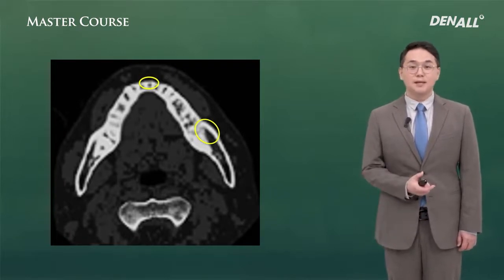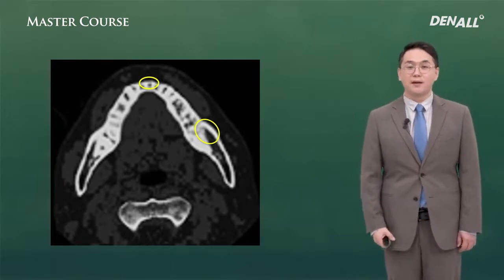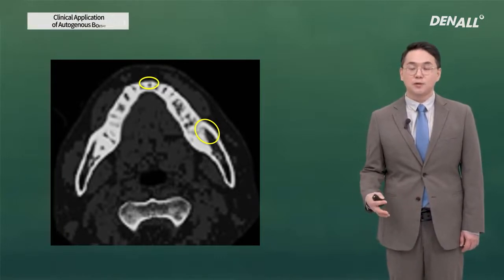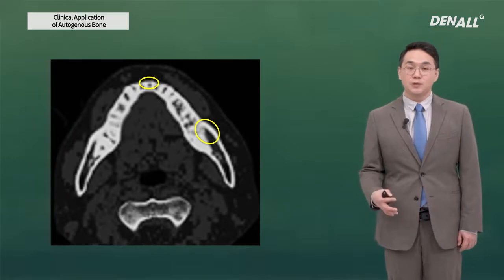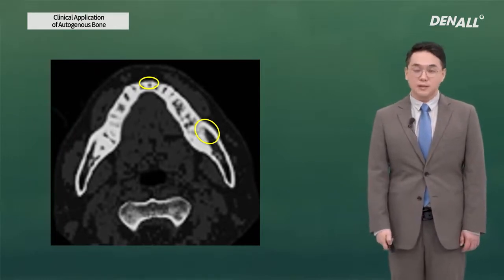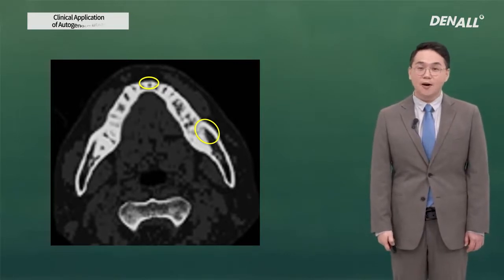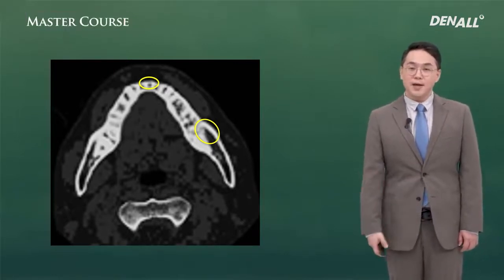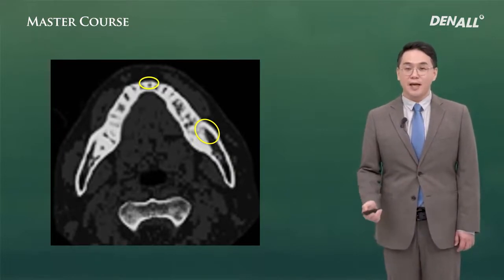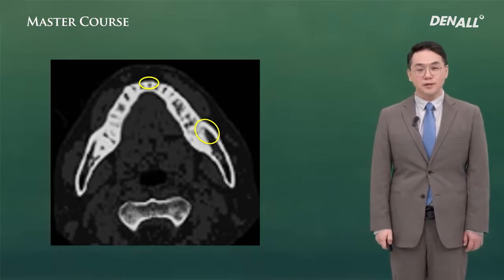If you use it in the full depth in the symphysis, bone bleeding can occur and there's inferior alveolar artery anastomosis, which will make bleeding more severe. So at the symphysis or chin, do not go to the full depth and stay within the cortical bone. In the ramus, there's no problem if you go to the full depth.